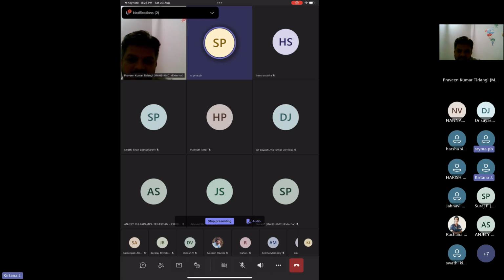But the most important thing on HFNC and NIV is to see how the patient is breathing. This is practically how I have made a decision, because a patient who is having too much respiratory effort on HFNC or NIV is going to worsen. So it's very important if you use either HFNC or NIV. There is nothing head to head as such, but I prefer HFNC for the comfort and tolerability.